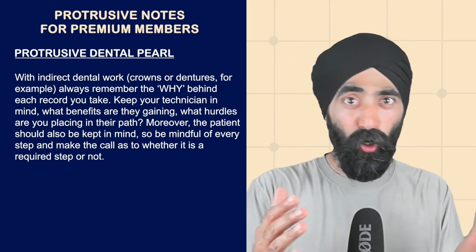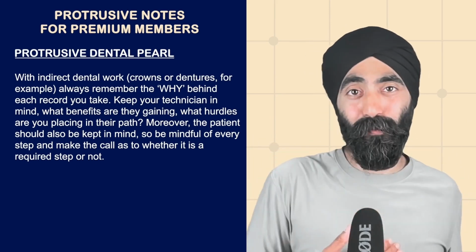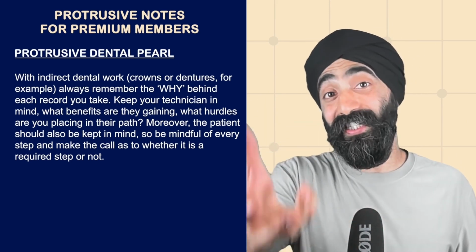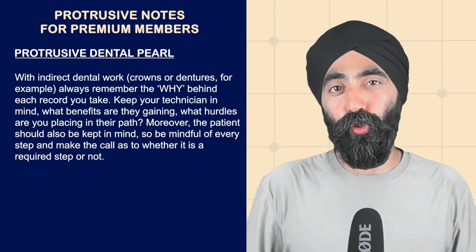Is it critical or is it not? In that case, my air bubble wasn't critical. I didn't have to bring my patient back. And so when you really think what the technician is getting from you and what compromises that you may accept, it can really help you advance your prosthodontics.